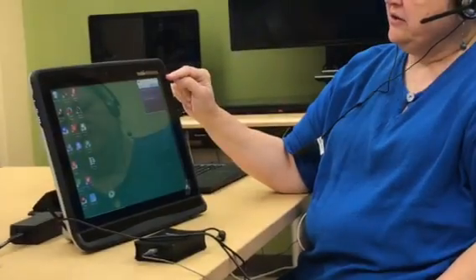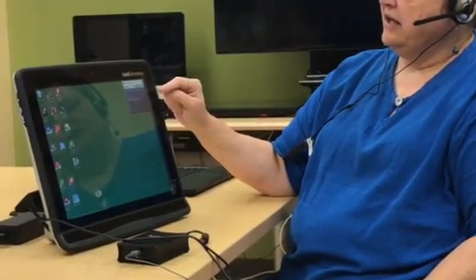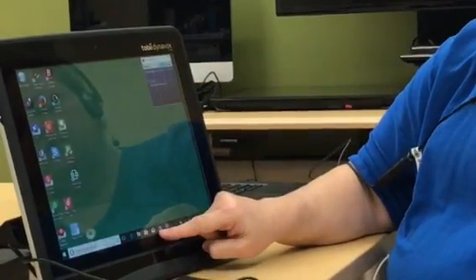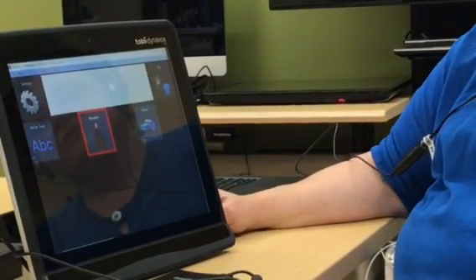Up here in the corner it shows activation of the switch when Talena raises her eyebrows. It will go over the baseline and then it activates the switch. Then you bring up the communicator software or whatever software you're going to use, and it will act as a single switch.